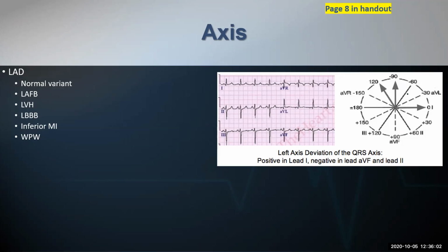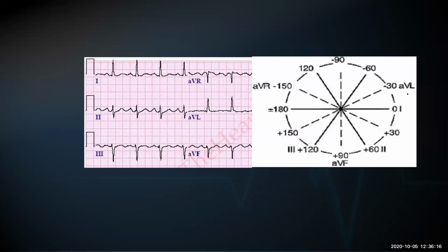Also know that on the EKGs, as was brought up during our rounds a few weeks ago and even last week, the EKG will give you the axis. It'll give you the number, which is the degrees that it's telling you. I don't want you to get used to just going off that. I want you to understand how to draw this out, to understand it conceptually, and then you can use that number to confirm your finding.